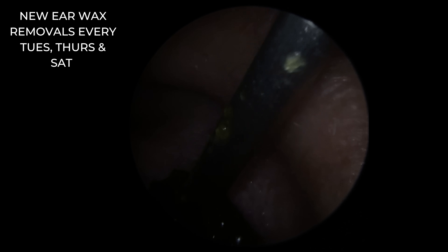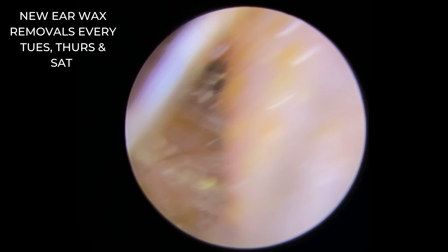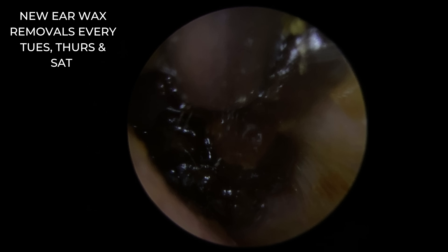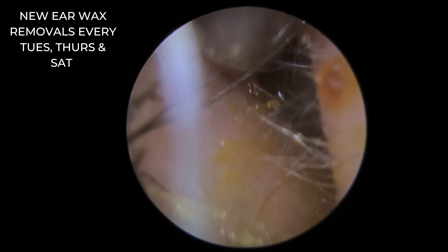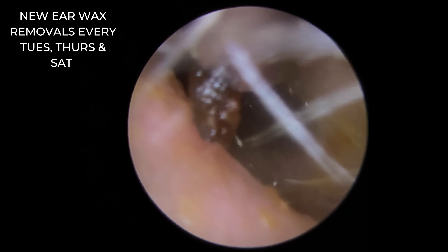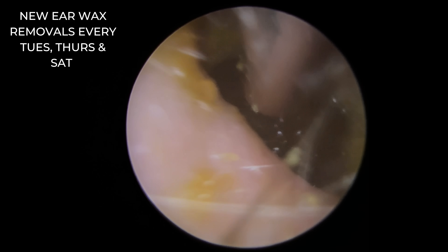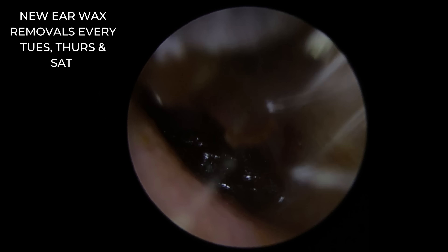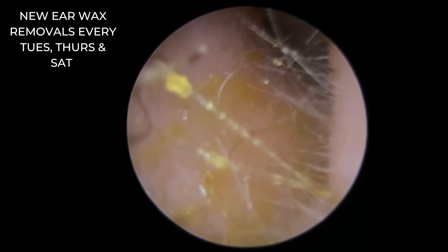Just popping that into the bowl of the year — let's lift it up with the suction. There's that piece of wax. If we take a look behind that, we can already see there's another piece further in. So let's take this section from the right-hand side — we've got that central portion of wax sitting right on top of the eardrum. It's coming in three little bits by the looks of it. Can't quite see the eardrum, but I'm sure we will be able to once we've taken that little piece out of the canal.